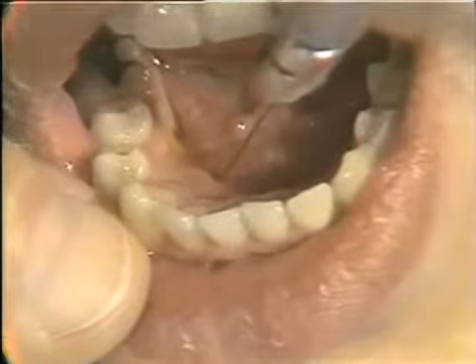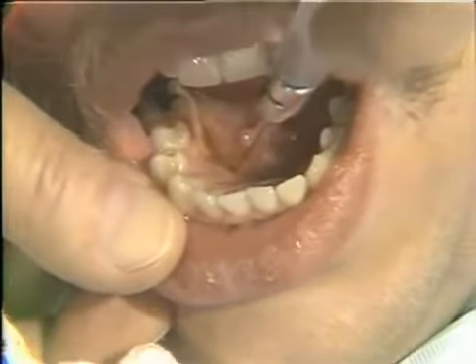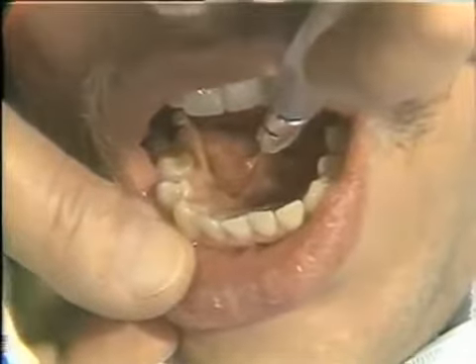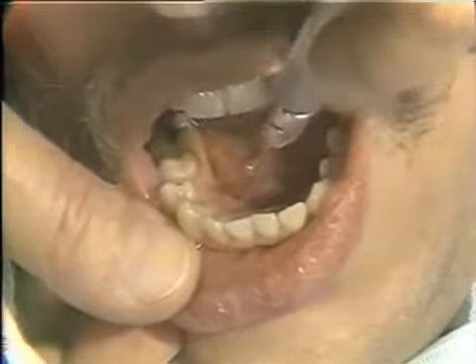And I am aspirating now. Everything's fine. And very slowly we'll inject about a half a cc of solution in this site, and this will very adequately anesthetize these lingual soft tissues adjacent to the cuspid.